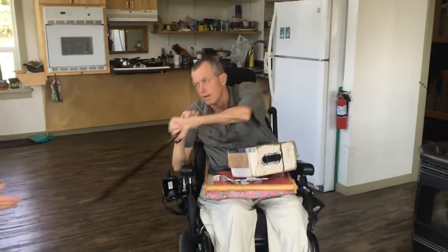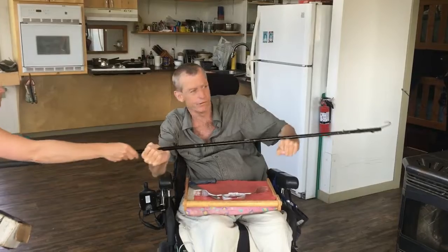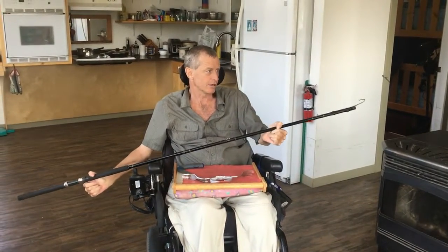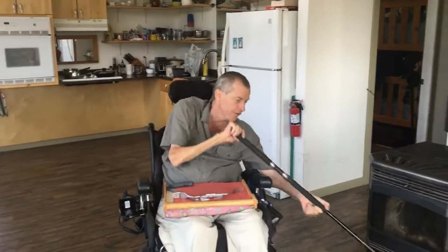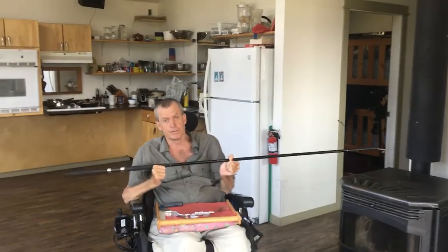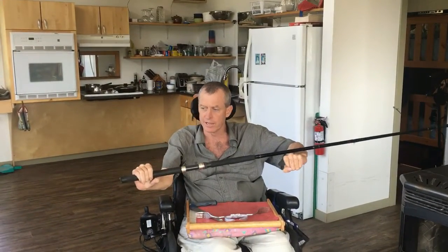Now, if you want to go a little more extendo on your reach, this is a salmon mooching rod. It's fairly long and pretty stiff. It's just the butt end of it. And once again, I just stuck a coat hanger hook, zip tied it, taped it on. And it's good for reaching farther down. Maybe you want to get underneath the shelf, or you want to get a little bit higher up like that. And the nice thing about fishing rods also is they're super, super light. You can throw them around pretty good. And most of them have a pretty grippy end on them that you can get your hands on.